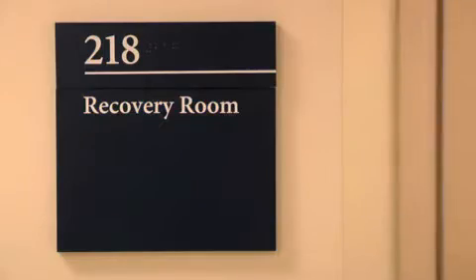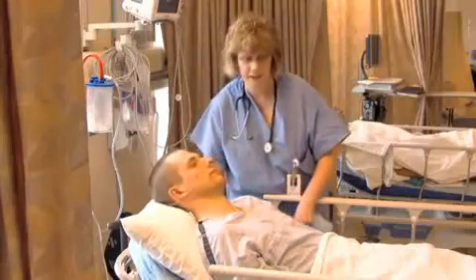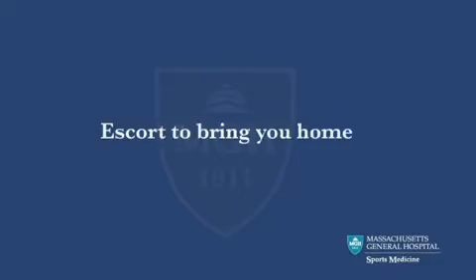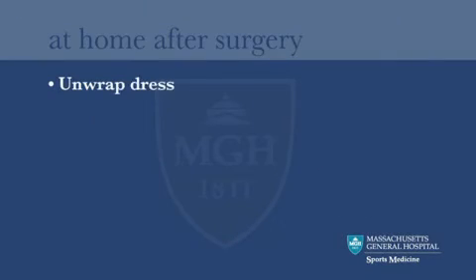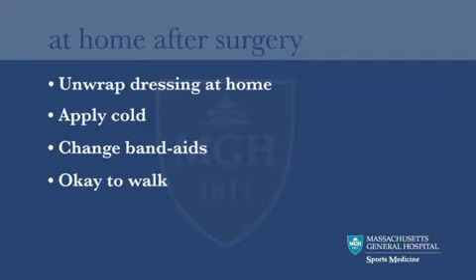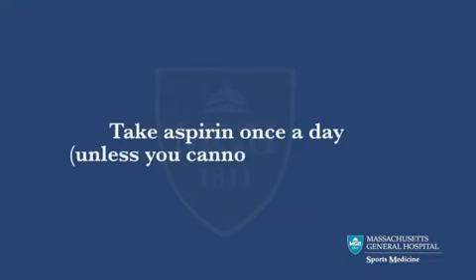Sometimes several openings are needed. The doctor watches the television screen so he can see what he is doing inside the joint. When you wake up in the recovery room, you'll be drowsy and should not have much pain. However, the Novocaine will wear off several hours later and the knee will be painful. If you have had general anesthesia or sedation, someone will have to pick you up to bring you home from the hospital. You can unwrap the dressing when you get home and apply ice directly to the joint. Change the Band-Aids whenever you like. You can walk on the leg, but this will be painful in the first few days. You can wash or shower starting 2 days after the procedure. Unless otherwise instructed by your doctor, take 1 or 2 aspirin tablets a day for 1 week, as this helps prevent phlebitis or blood clots.